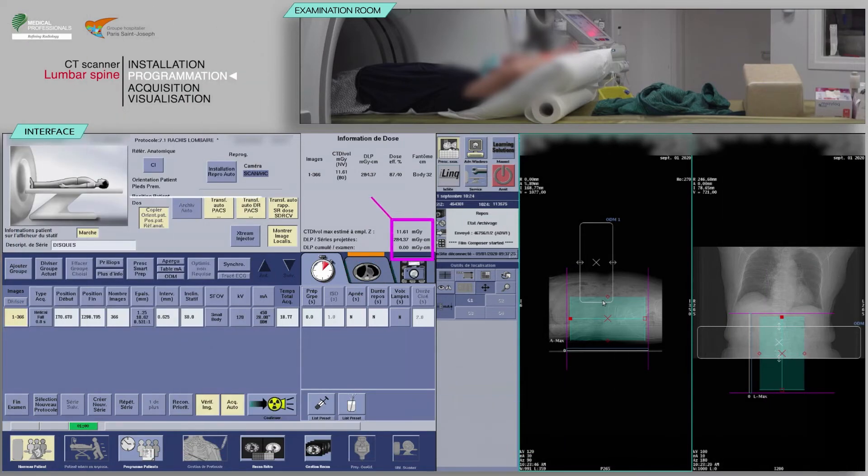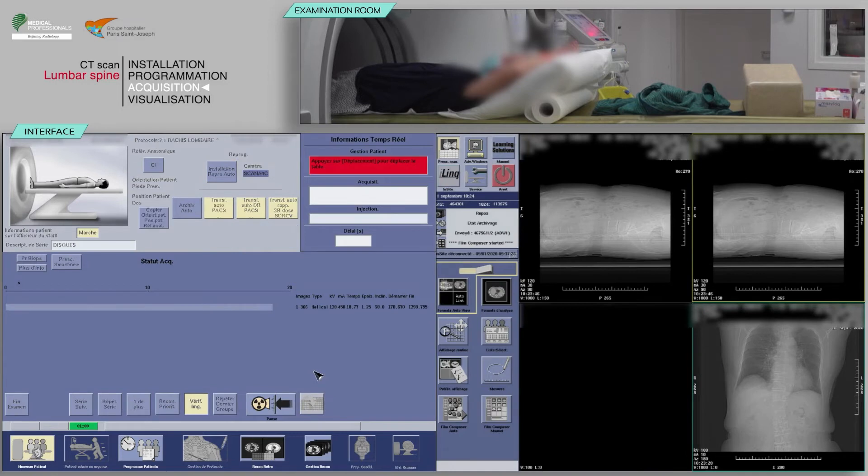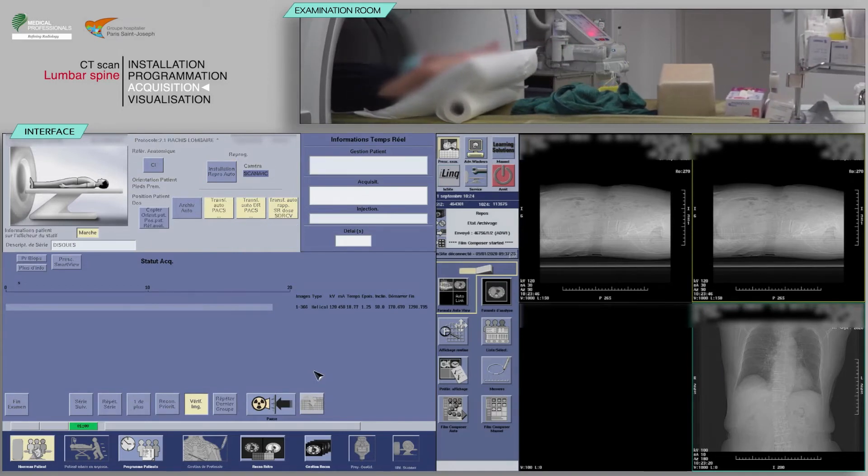Before continuing, check that the predicted dose is consistent with the diagnostic guideline values. Click Confirm. On the keyboard, move the table and proceed with the acquisition when the buttons flash.